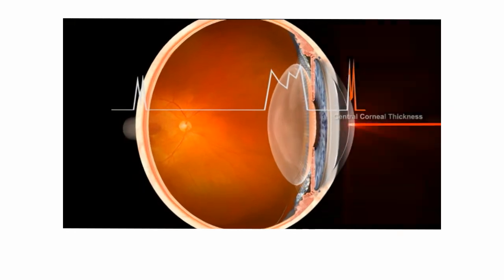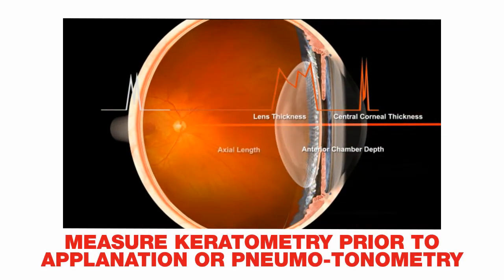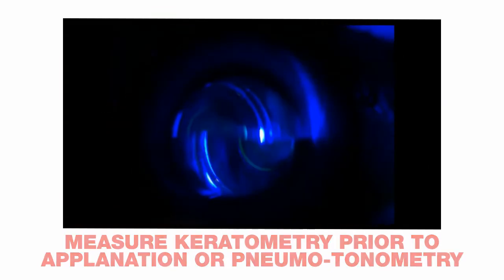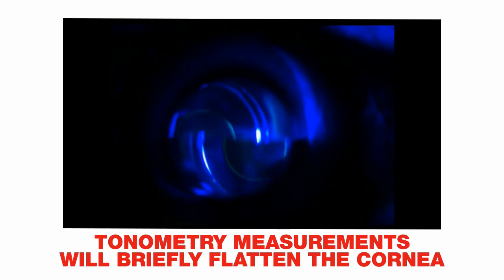It is highly recommended to measure the patient's keratometry prior to applanation or pneumotonometry to increase the quality of the measurements. Tonometry measurements can flatten the cornea briefly and reduce the quality of the keratometry results.